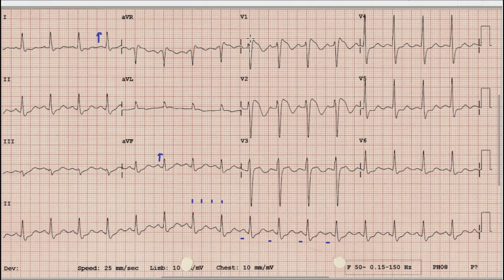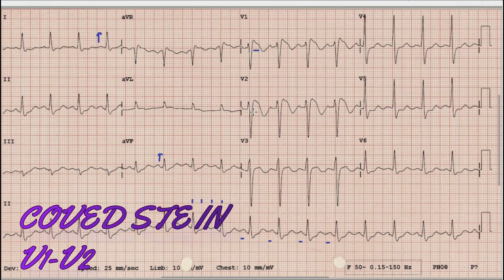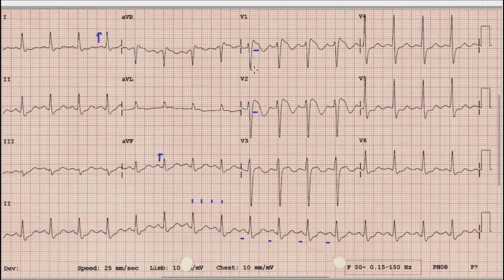When we look at the anterior chest leads, especially V1, V2, and V3, we can see that there is prominent coved upward ST elevation in leads V1 and V2. This ST elevation is around three to four millimeters in both of these leads, and it is followed by T wave inversion in V1 and V2. This T wave inversion is also present in lead V3.